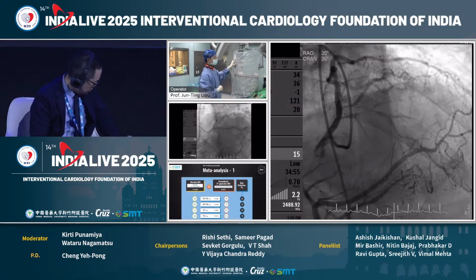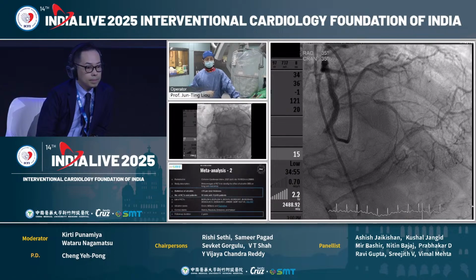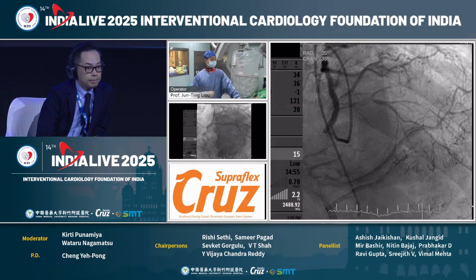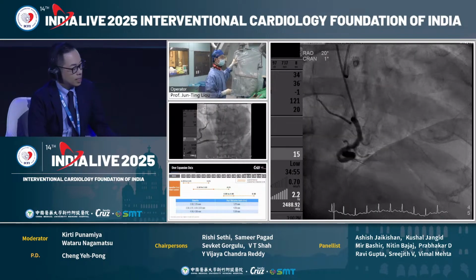So today we tried many times with an antegrade approach using several guide wires. Initially, the wire went outside of the lumen. However, fortunately, maybe you can see what we did in the next procedure. Can we go forward? Yes, please go ahead.